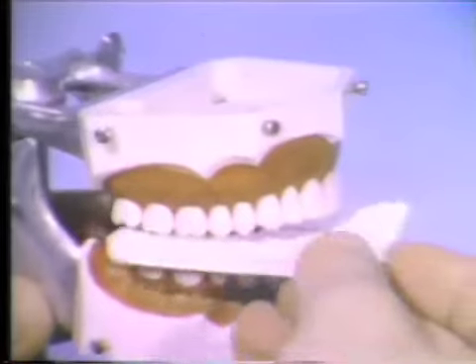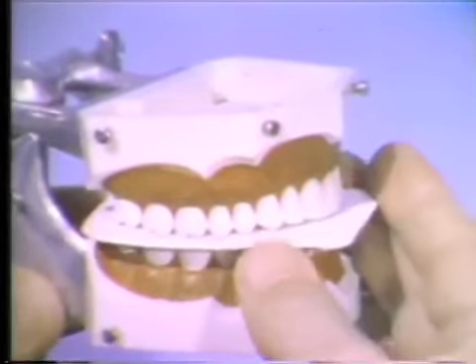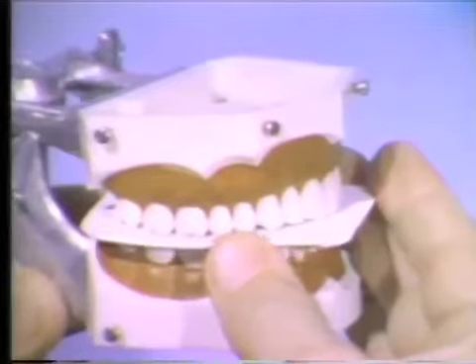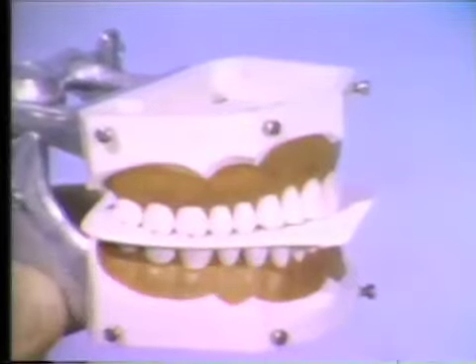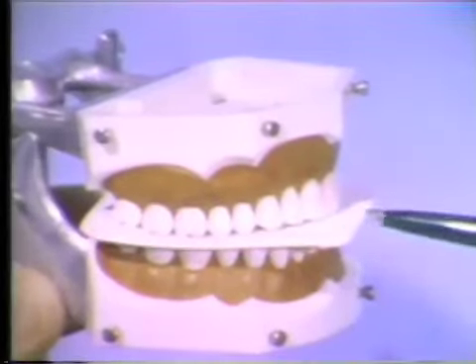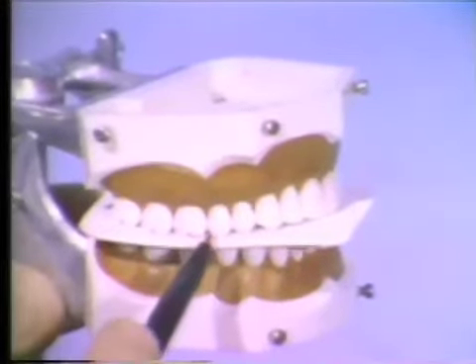Using a typodont for demonstration, the film is inserted with the sensitive side against the upper teeth. Since this is a right maxillary projection, the 1/4 inch border is positioned just outside the buccal cusp line of the right posterior teeth. The guidelines to the center of the film are visible at the front and side edges.